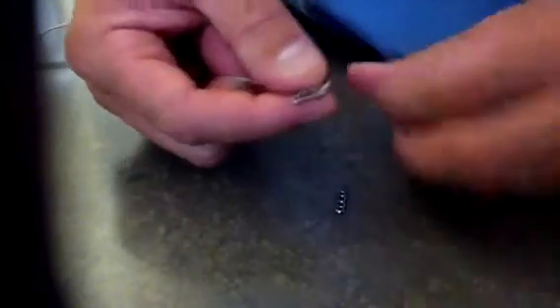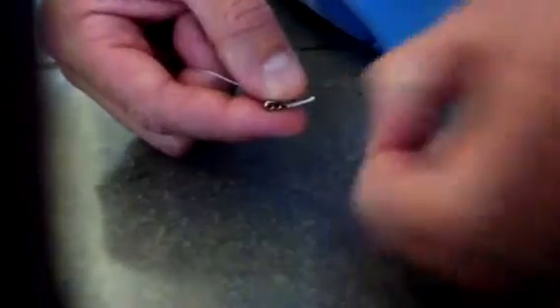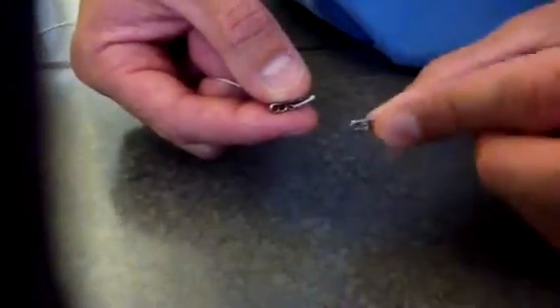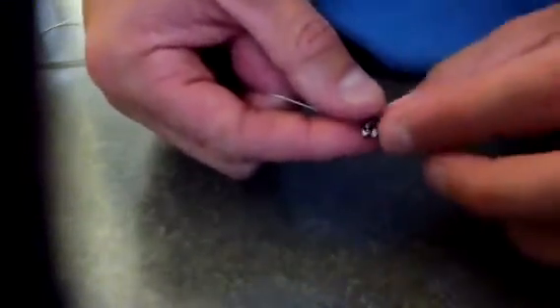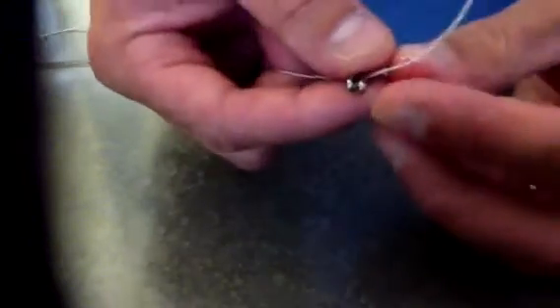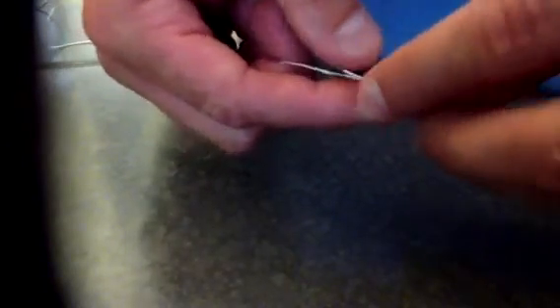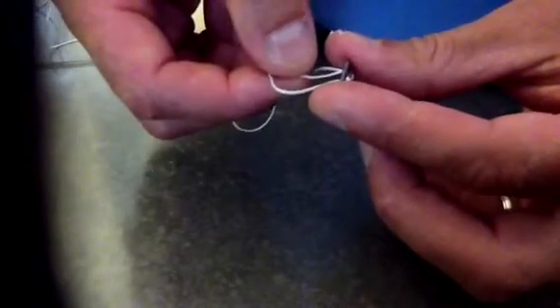I'm going to come through the inner islet of one endo button, then come through the inner islet of the other endo button I have in my hand. Then I'm going to line them up and stack them together just like this. I take the free end suture, come through the two inner islets on the opposite side, and pull it tight.